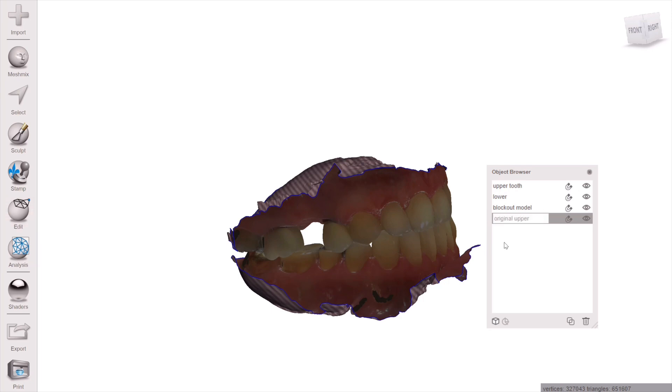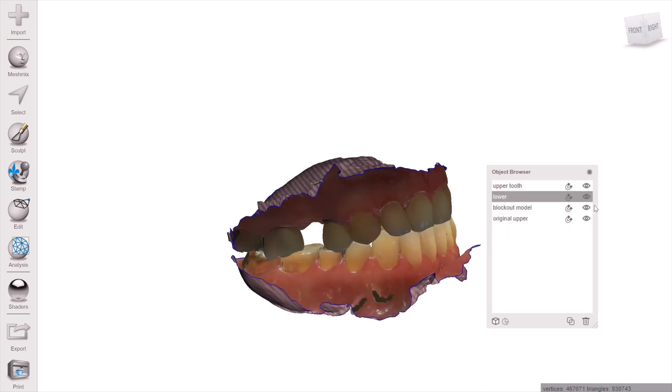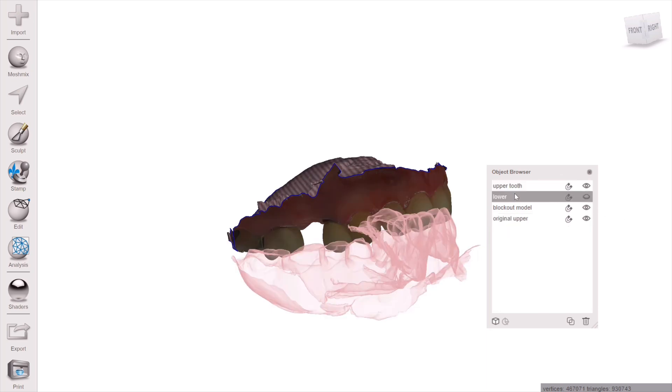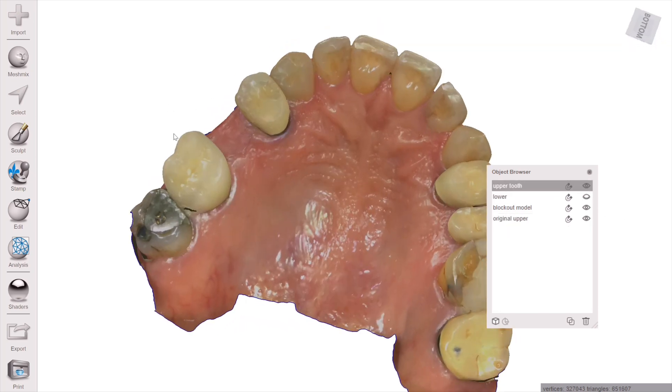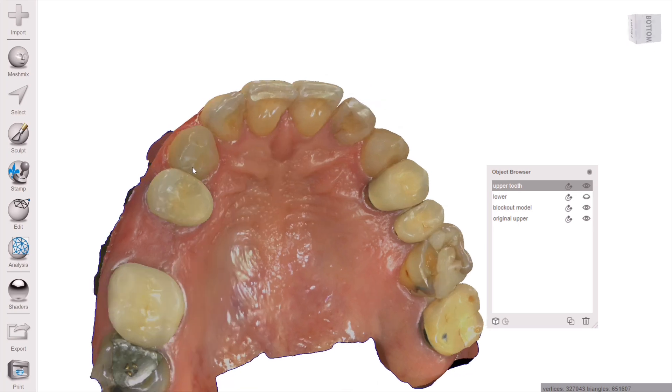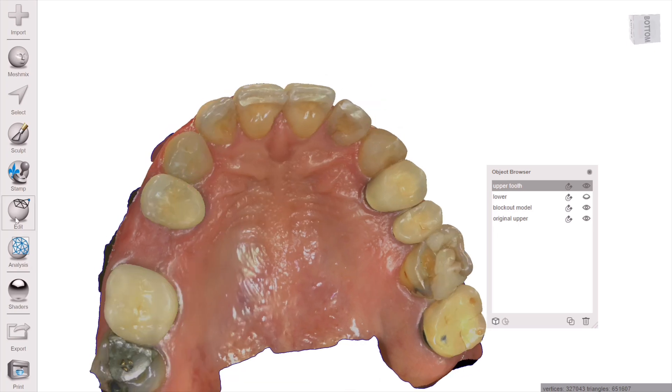If you don't see your Objects Browser, just go up to Visualization and turn it on.